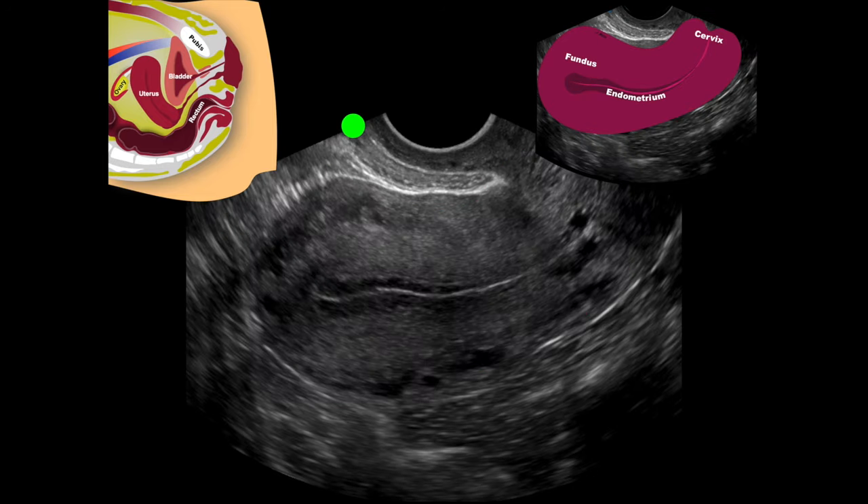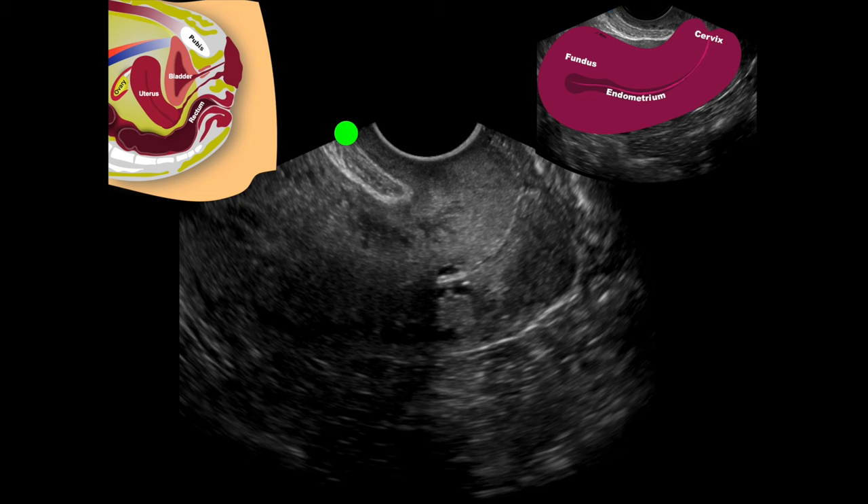Here's a live image of that: we can see our fundus and our endometrial line running right down through. If we can't see the cervix on the initial view, because this is anterior and this is posterior, you just lift the tail of the probe up and look posterior, and you'll be able to see the cervix. We can see the endometrial line continuing, here's the posterior portion of the cervix, and here's the anterior portion.